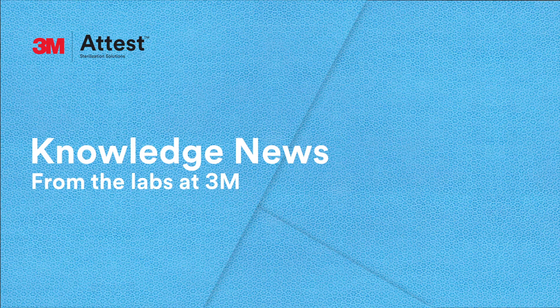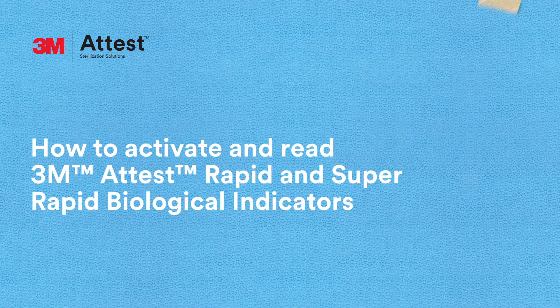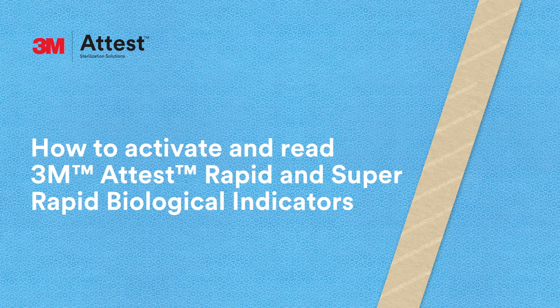Hi, I'm Steve. Welcome to the 3M Lab. We're here to help you learn more about steam sterilization monitoring. Today, we'll talk about how to activate and read 3M rapid and super rapid biological indicators.